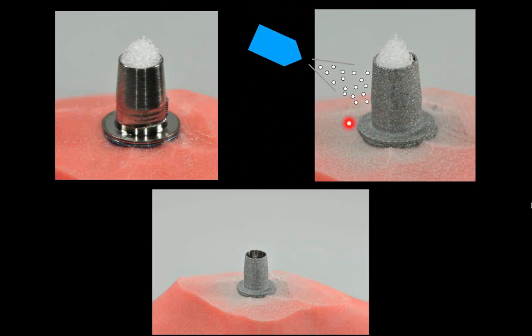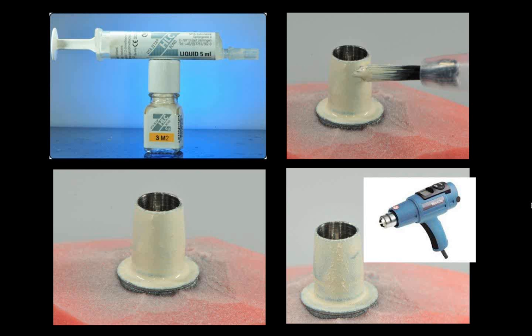So it's been sandblasted. After sandblasting, I clean this out, I take out this foam piece, and then I use a product called HLC Bond. And this is a fantastic product. I think VITA is going to discontinue it, so we have purchased a lot of these bottles and this paste. You paint this on, like you see here, and you take a paint stripper, and you heat this up, and it starts steaming, and it bonds and fuses to your metal frame. And now basically we have completely masked out our titanium abutment.